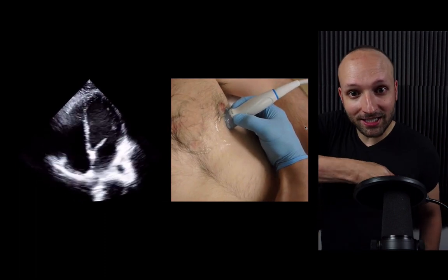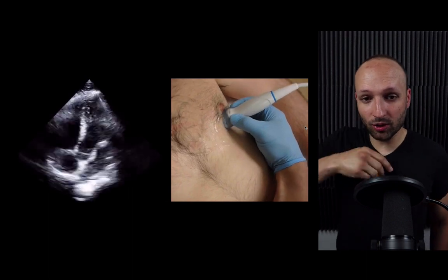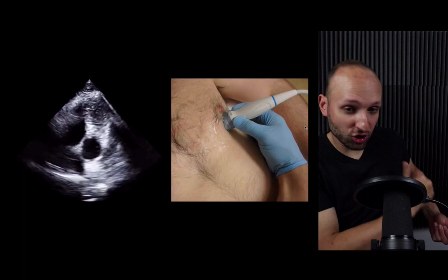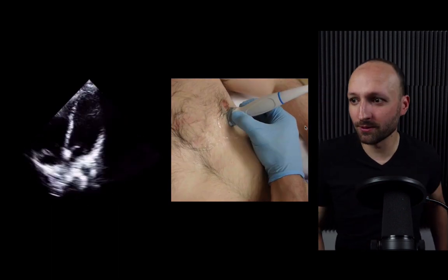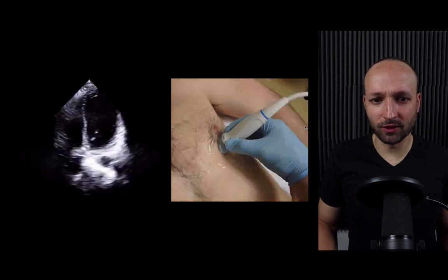Remember, the heart actually sits diagonally this way. It's not just like up and down, it's sitting sideways. So if you just bring that tail over, you're much more likely to get it right at the apex and shooting straight through towards the base of the heart. So right there, great views.